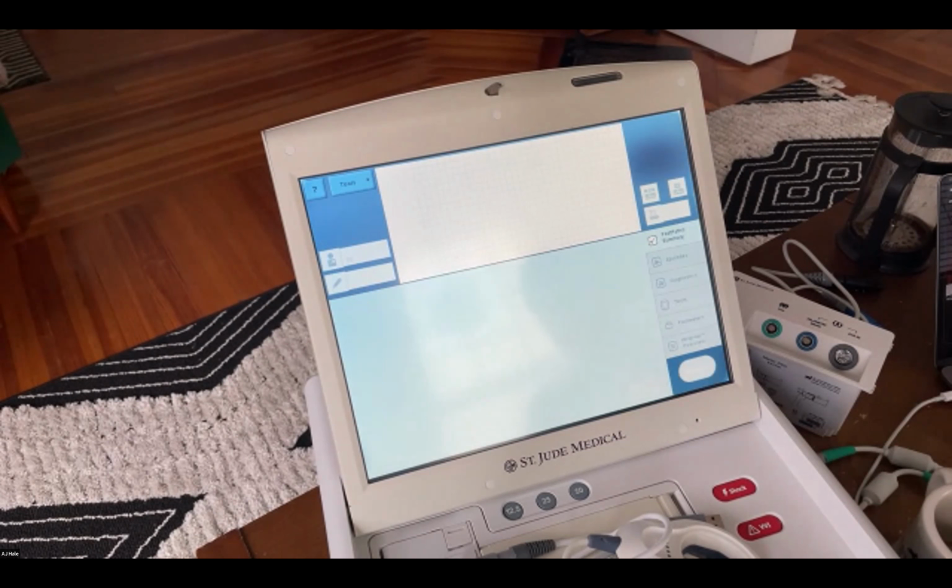I've used this before for patients who have a defibrillator and they'd want to cardiovert them. They actually use the implantable device. I don't have a recommendation whether or not you should do that or not, because I don't have any data, but it's not typical to use an implantable device to shock for AFib. They may use it if a patient is in VT or things like that as well, to go ahead and break it up, but still waiting for this to come online.